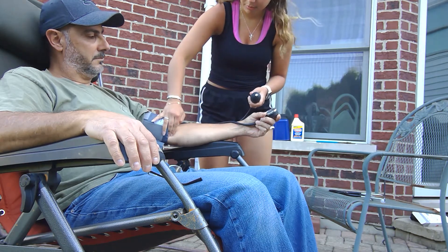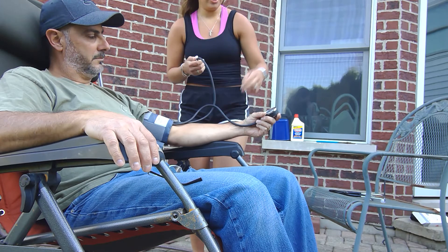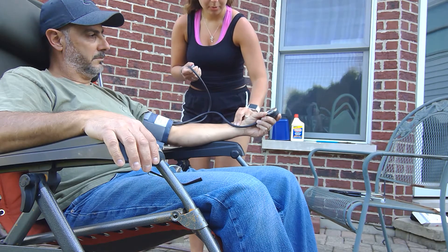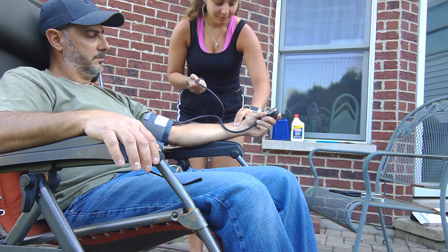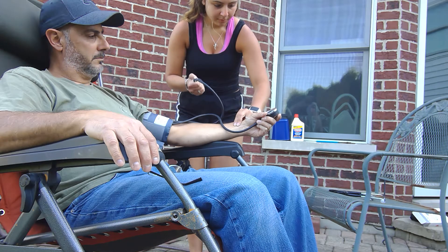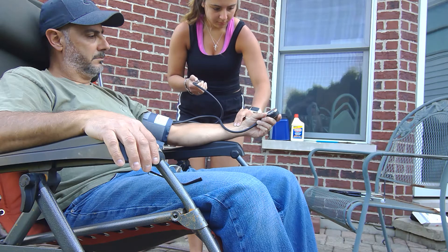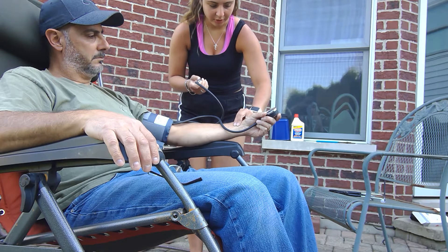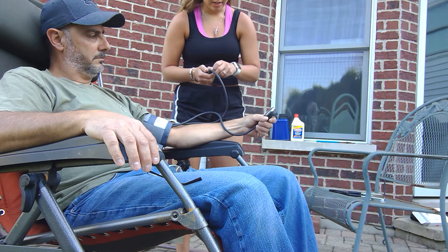I'm going to find where his brachial pulse is, and then I'm going to find his radial pulse and pump it up until I don't feel his pulse anymore, to find his estimated systolic. It's around 120.